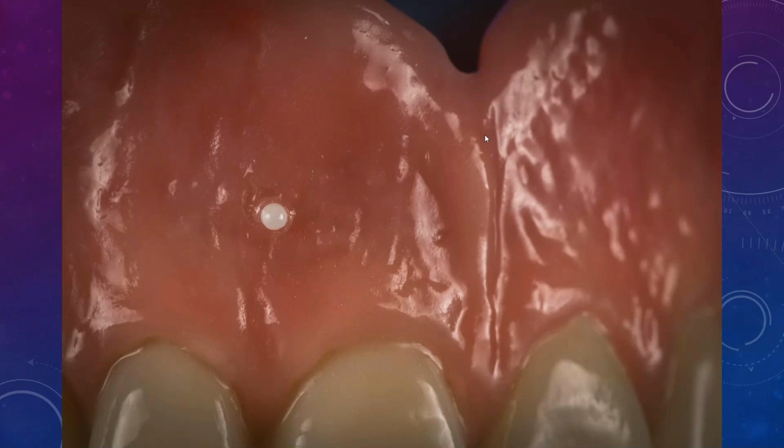You could just put zirconia bits right on the surface of the denture and attach them with a little Optiglaze that holds it in pretty well for the time being, and use that as your scan.